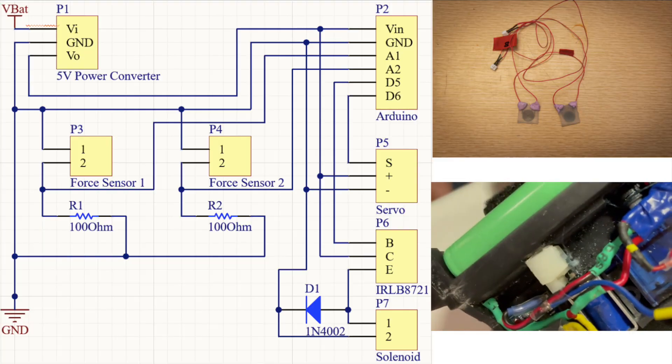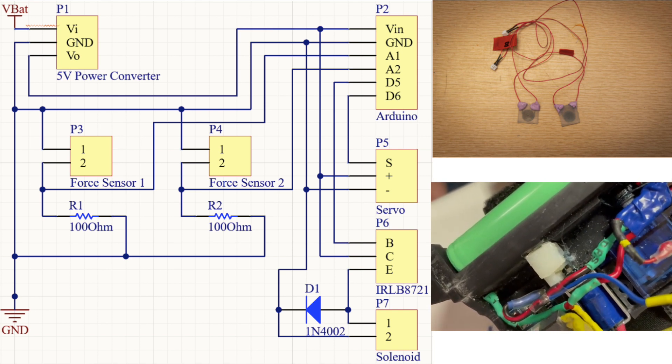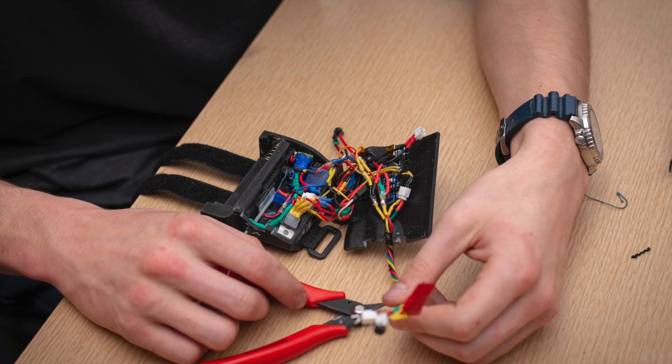The electrical system shown here drives a solenoid that locks the thumb position. With this design, we were able to use a small motor and still resist large forces in the thumb.